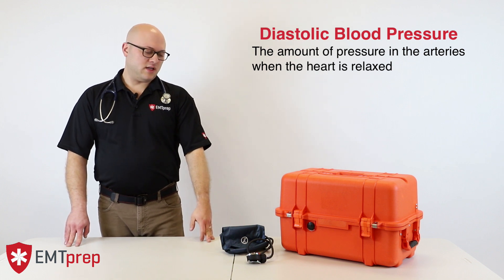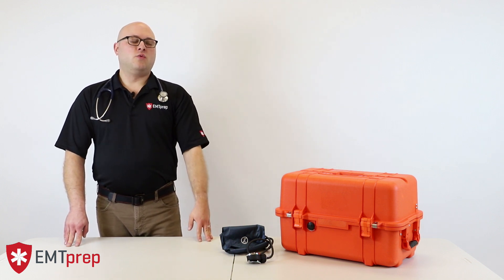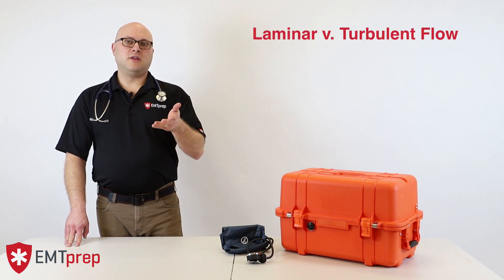The way that we measure this manually with a manual blood pressure cuff relies on essentially the physical principle of laminar versus turbulent flow.